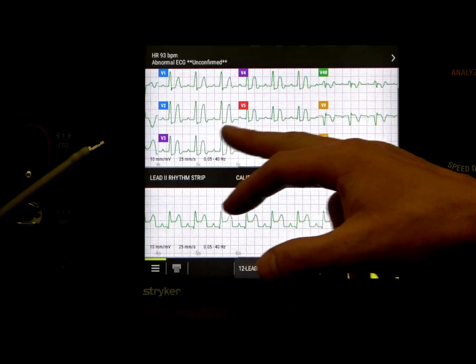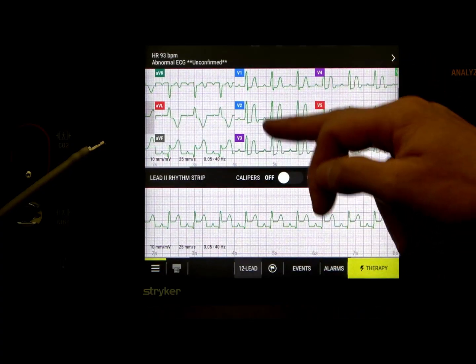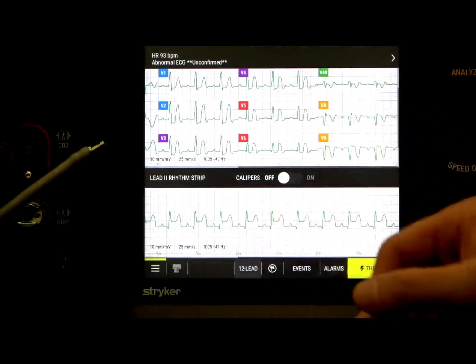So, just a reminder, that anterior septal, those leads that I see depression in, those are the inverse, using the Pales analogy, of that posterior wall. And so that's your telltale sign, if you were just performing a regular 12 lead, that your posterior wall might be impacted and you should perform further assessment. But for this, we already have them hooked up.